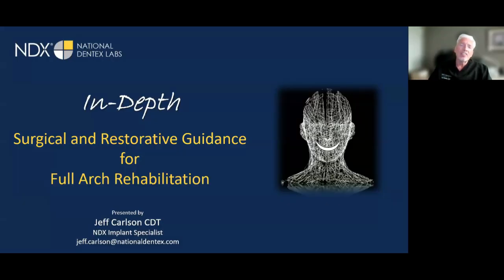So as I'm thinking about this right now, I'll just say that if you are collecting records for a case, and you're not sure if something that you've done digitally is good enough, do go ahead and do some impressions, PVS impressions, things like that, just to back up again for cross validation. We want to make sure that we're giving your patients the best possible outcome that we can.